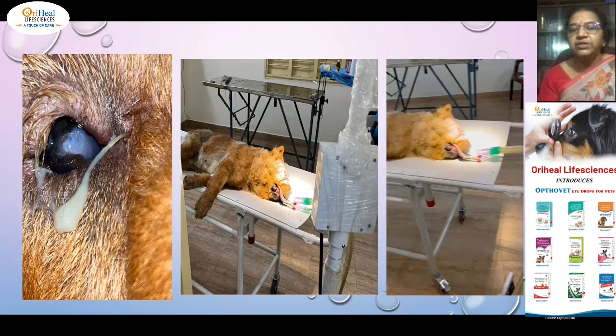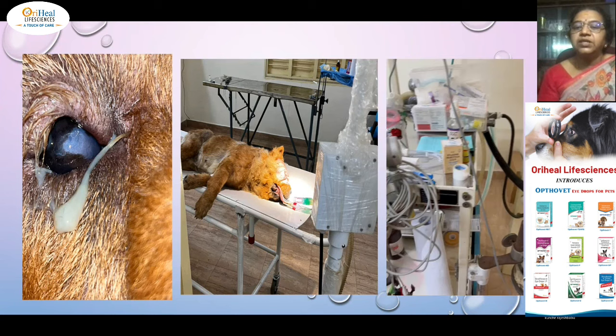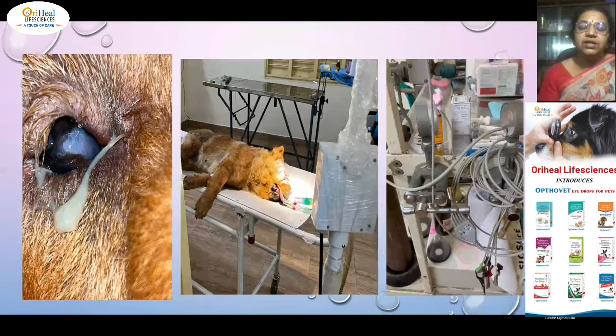In this video you can see the animal is now positioned and kept on the anesthetic apparatus. It is under general anesthesia. So this patient preparation itself needs a general anesthesia. So now coming back to our first point, microsurgery, time is trauma, is very important. So the anesthesia starts from the preparation of the site. It is not like other surgery where preparation of the site can be done under sedation, and under general anesthesia you can actually do the surgery, but here it is not so.